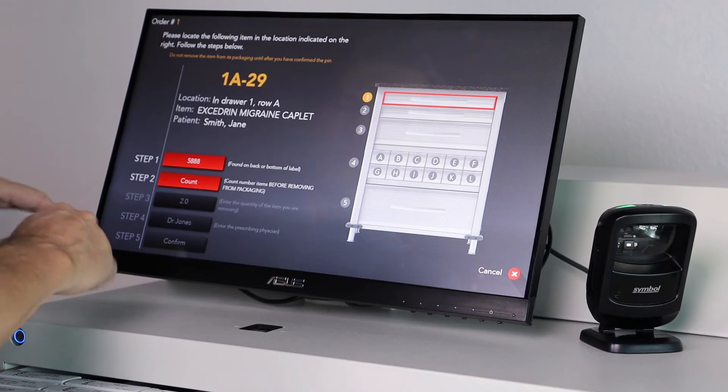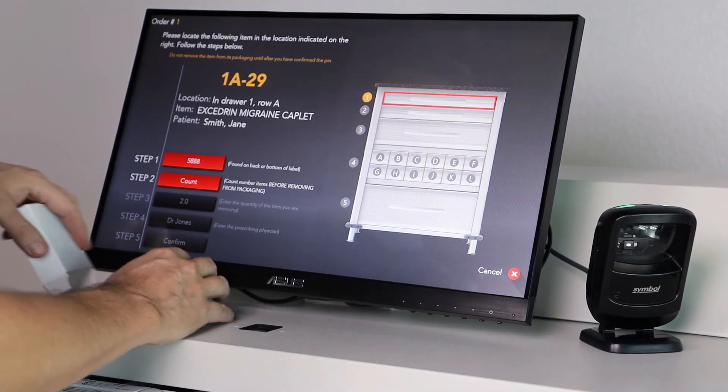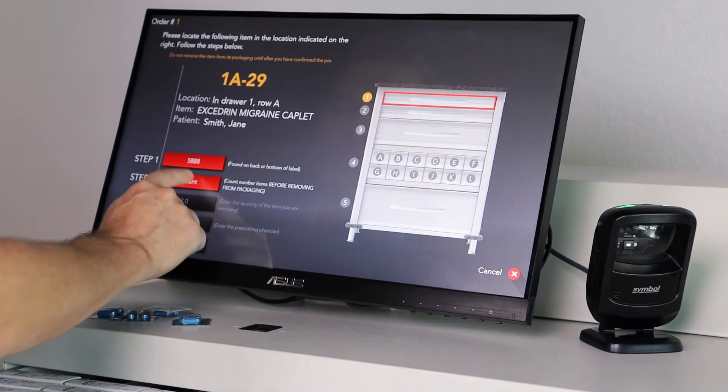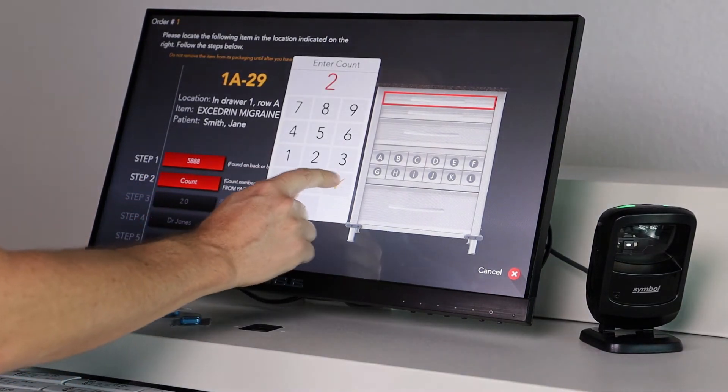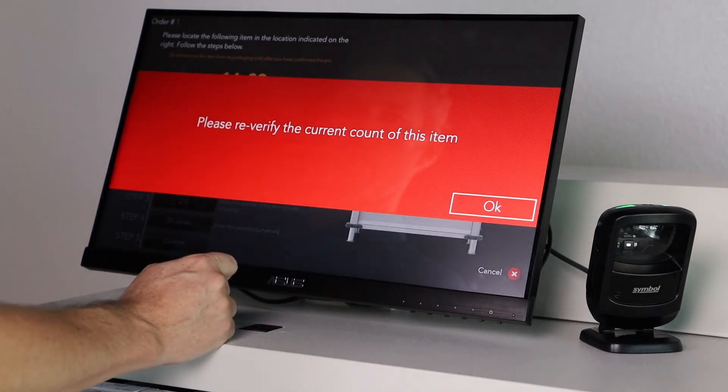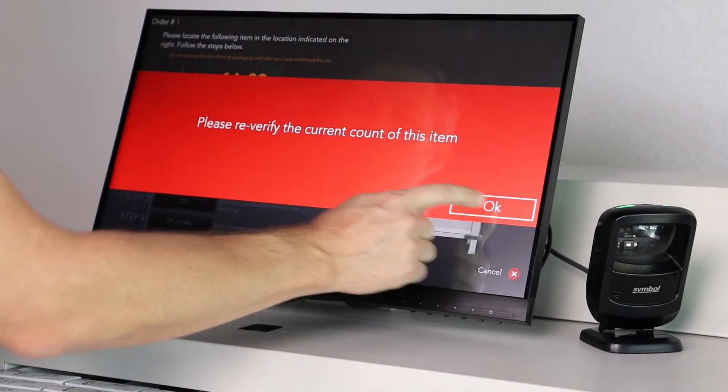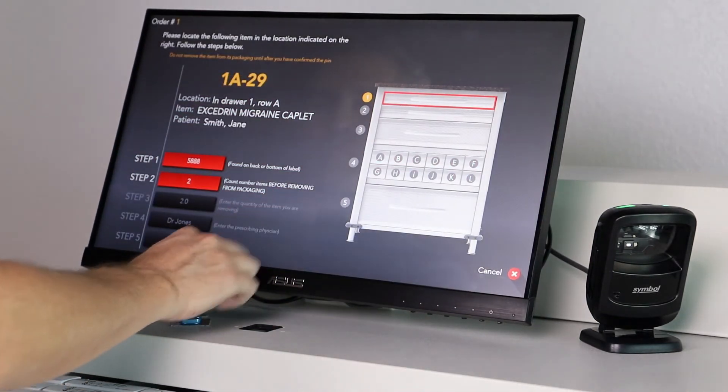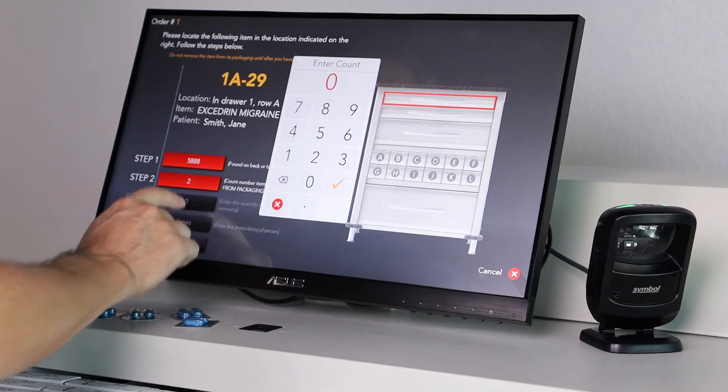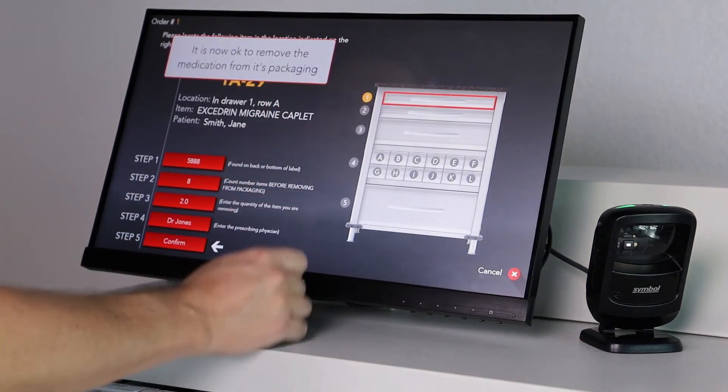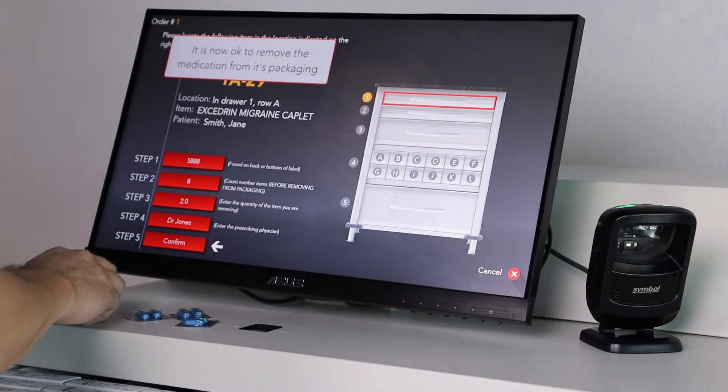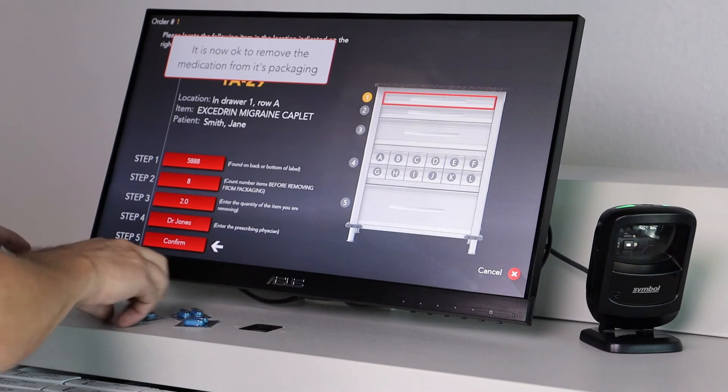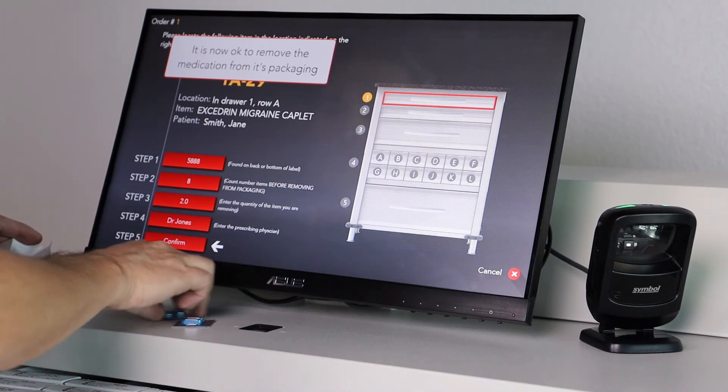Statsafe allows one correction on the blind count. If the second entry is incorrect, it allows the dispense to move forward and records and reports the discrepancy.